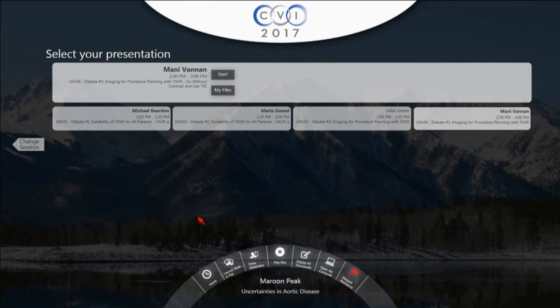Siemens software. So it does everything. But that is the only automated software. There's only automated software in Siemens. Other companies don't have an automated one. Right, although Philips is onto an automated software, they're all becoming automated. I think automation is going to be key when you're handling volume data, especially TE data, because it's too much data. You cannot be drawing these lines in X-planes and Y-planes, etc.